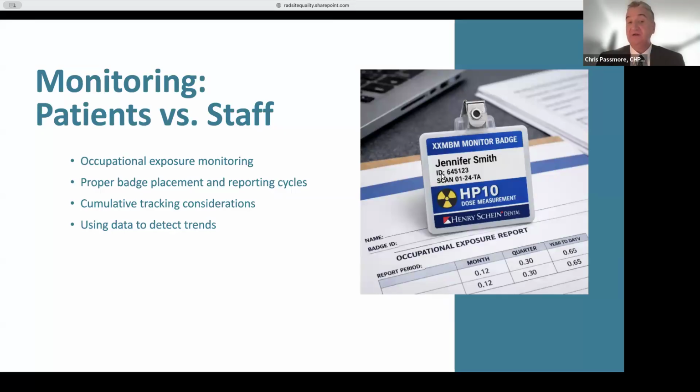Yes, by regulation, if you have a lead apron on, you've created a non-uniform field. So you should put the dosimeter in the highest location or wear multiple dosimeters. Typically you would place the whole body dosimeter in the highest location where you expect to get the radiation exposure. That could be the head, the upper arms, the torso of the body, or the upper legs.